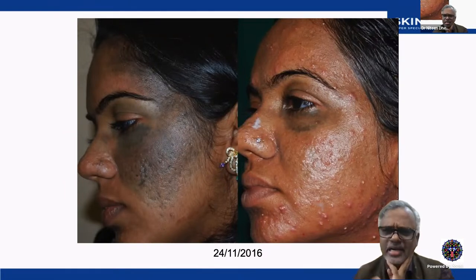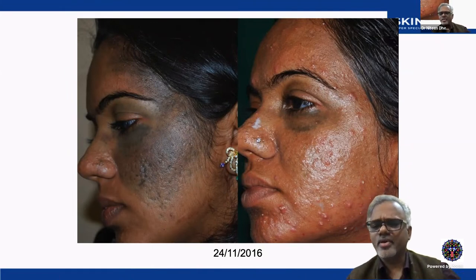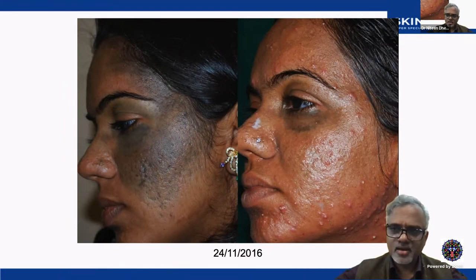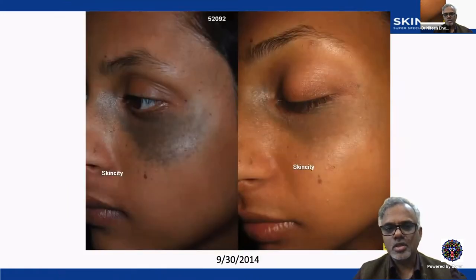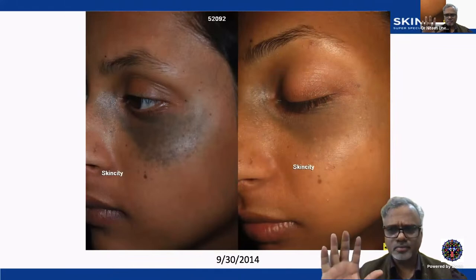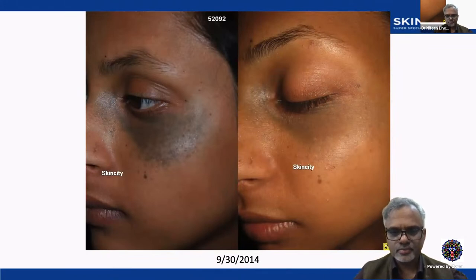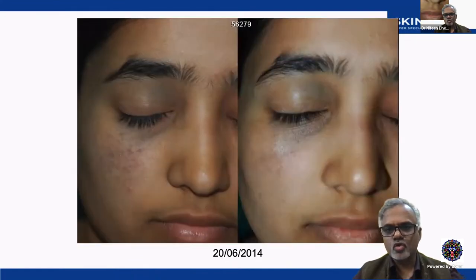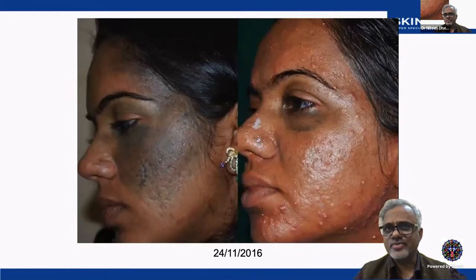So usually we treat less on the eyelids for two reasons. One, for a safety reason, but that's not really a real thing. I usually keep the eyelids behind because this will help the patient appreciate how good a clearance they got on the face. Then in the second phase, I again treat for a couple more sessions on the eyelids. So the eyelid acts as a control to appreciate the results. This is nevus of Ota with Q-switch Nd:YAG laser, 1064 nanometer, spot size 4, fluence around 6 to 10 joules per centimeter square.